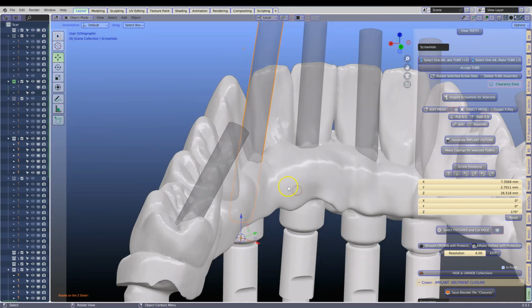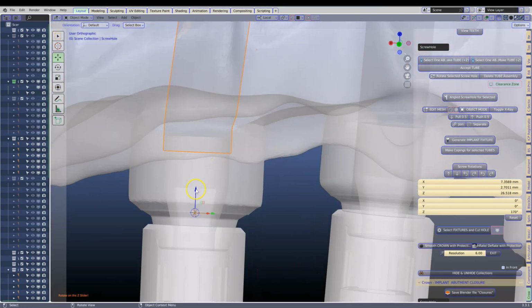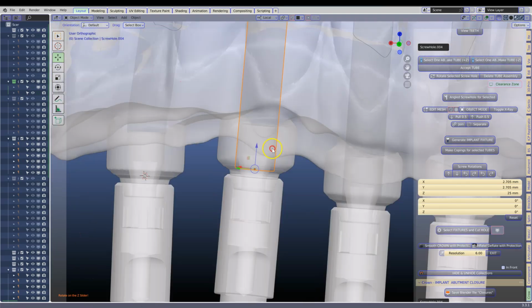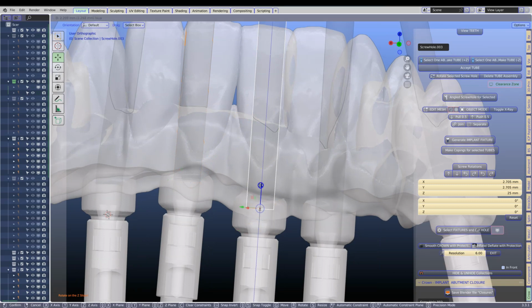That's looking good. But we need to also make sure that it is in the correct spot. So we're going to just move that up a little bit like that, because the screw is retained over there. And then the angle goes in there like that. Now we're going to have to do this to all of these. So here, just going to move this to the top like that.